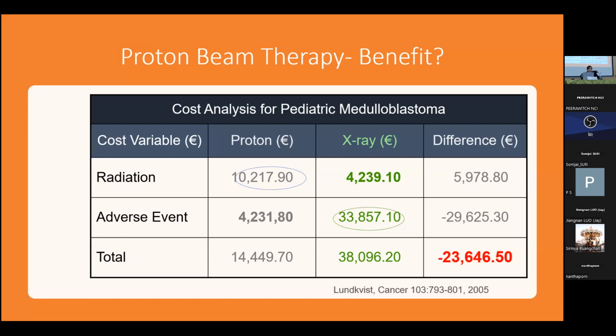So sometimes people really look at this and say, oh, proton therapy, particle therapy is really expensive. And it kind of depends how you're counting. It might be really expensive right that day, but when you take the long-term approach, particularly as cancers are increasing and there's a trend toward getting cancers a little bit younger, but life expectancy is still a lot longer, there are a lot of benefits for proton therapy that are hard to quantify just immediately.